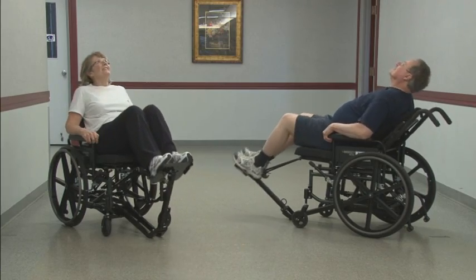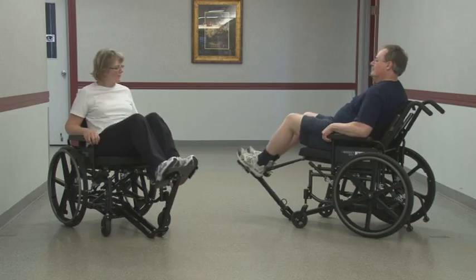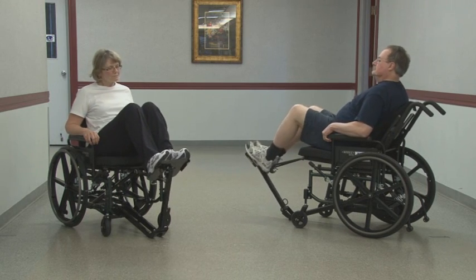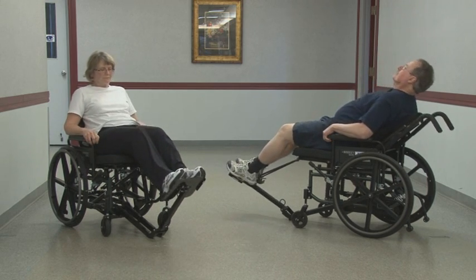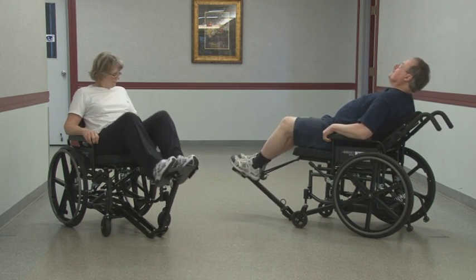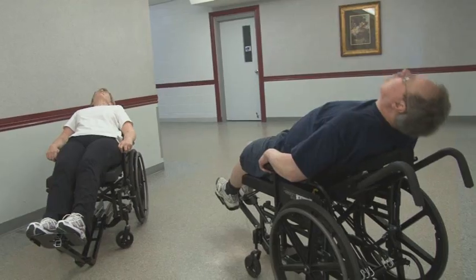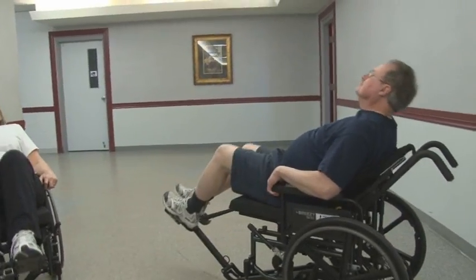The Neurogym Exercise Wheelchair is a revolutionary innovation that transforms a standard wheelchair from a passive transportation device to an effective gym. It creates an exercise environment for wheelchair-bound individuals. Passivity leads to atrophy and weakness. Activity leads to regained function.